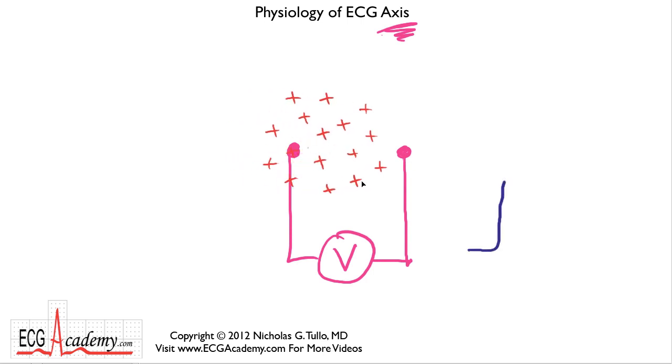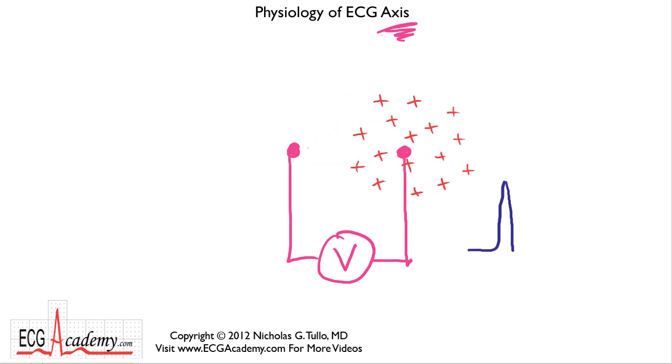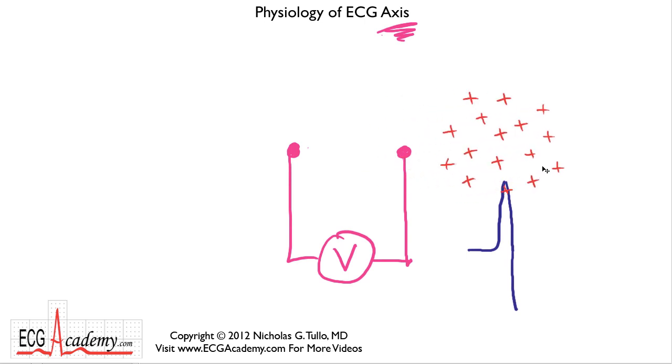As the signals move across, you might wind up with neutralization of this signal. So now both electrodes are at the same voltage, and the signal drops back down to normal. But as this electrical signal moves further, the signal has a potential for becoming negative before this signal finally goes on by and results in resolution of this electrical squiggle. Okay, so this was covered in the electrical theory and the circuits way back in the beginning of the course, but that's generally how ECG machines operate.